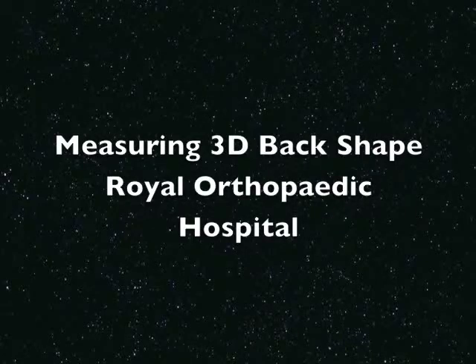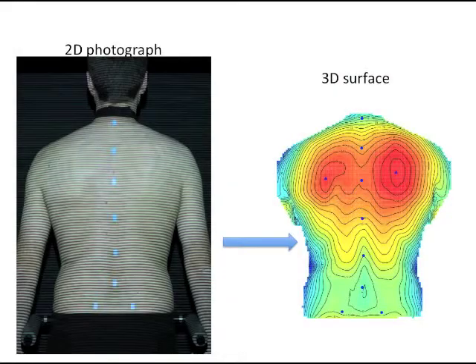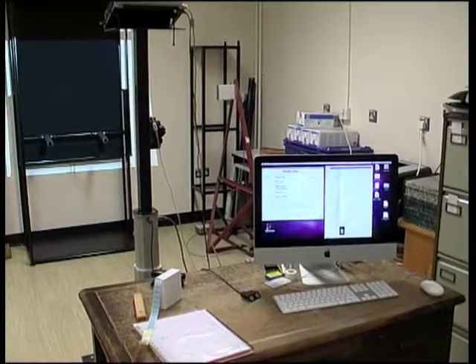Welcome to the Royal Orthopaedic Hospital Research and Teaching Centre Lab. We're going to show you how we measure 3D back shape from an ordinary 2D photograph. This is ISIS2, our system for measuring 3D back shape.